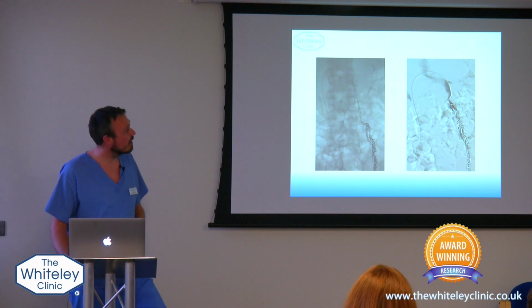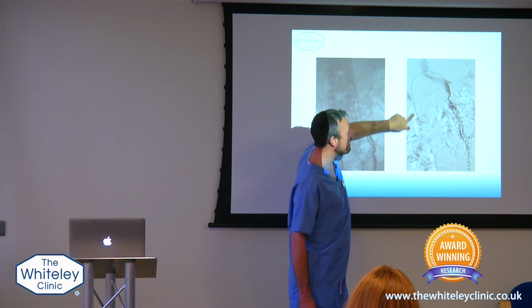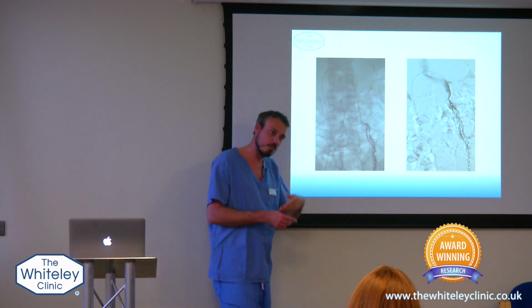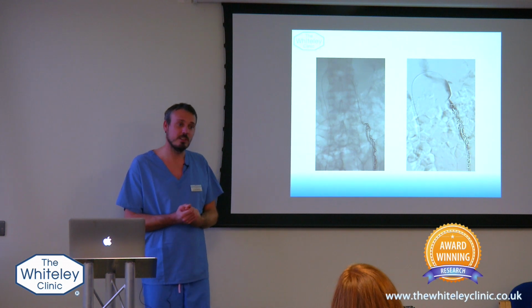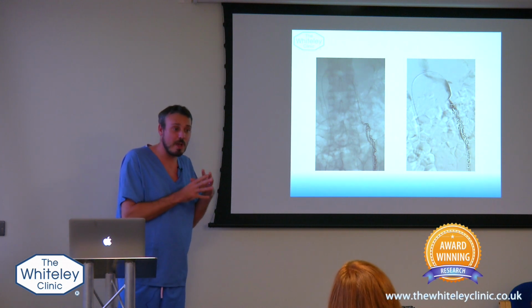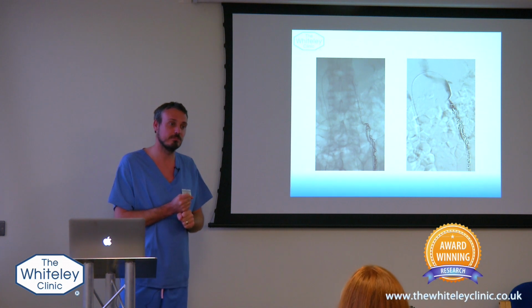And in actual fact, sometimes, in this case, I have gone from the groin. This is a male patient. Now, if you put the wire out, sometimes these veins are quite fragile, and you can easily push the wire outside of a vein wall. Doesn't matter. This is not an artery. You're not going to suddenly bleed from this. As soon as you do any damage, the vein responds by shutting down on it.